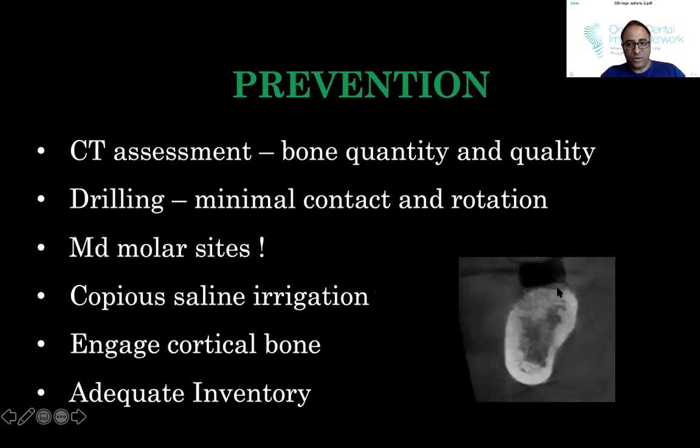This is a case here where you can see some grafting was done, but it's pretty soft on the inside, right? So drilling, minimal contact and rotation. Be careful because mandibular molar sites with this much bone and this much bone, you can get a spinner. So you have to evaluate the bone quality. And in essence, if you're unsure, under prep, right? Copious saline irrigation, so there's no debris.